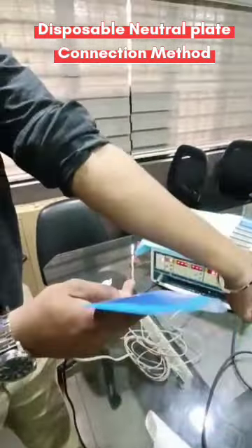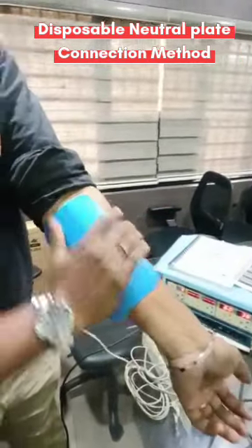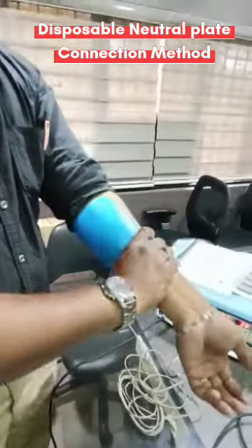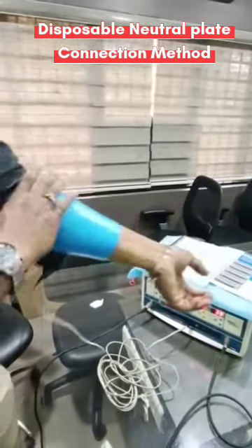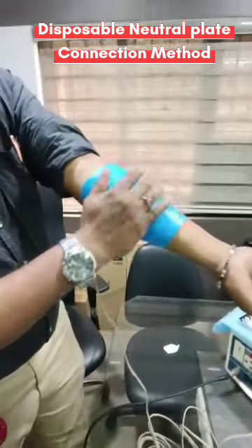After that, remove this paper and place the plate over the patient. Consider me as a patient — just place it over a good muscle area, either thigh muscle, back muscles, or back side of the shoulder. Once you fix it, you can see it gets fixed. Once you place the cable in the plate, it will be fixed like this.